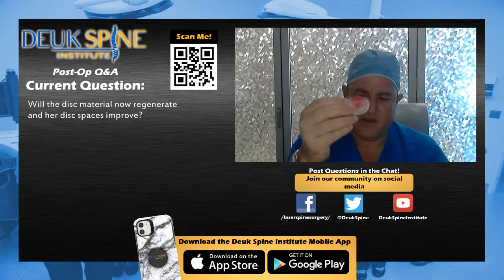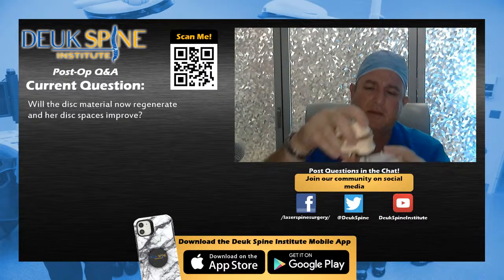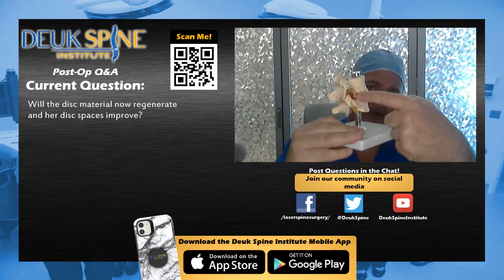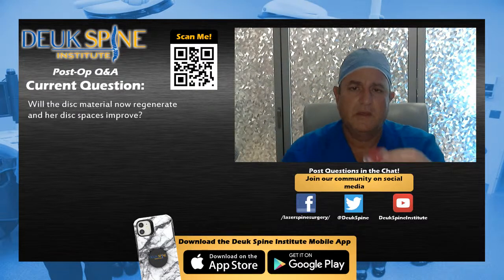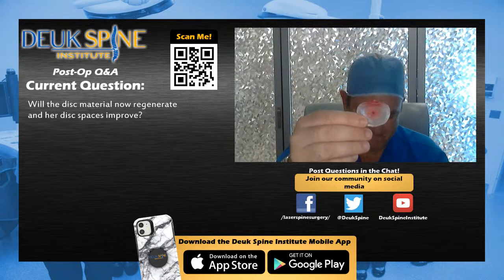This is a disc right here, okay? Normally you look at it like this, all right? So let's take a look. Right here. Bone, vertebrae, disc. There's the back of the disc where the tear is and the herniation. There's a nerve root that it's irritating. So I'm going to pull the disc out so we can look at it, okay? You see that? Can they see it okay?